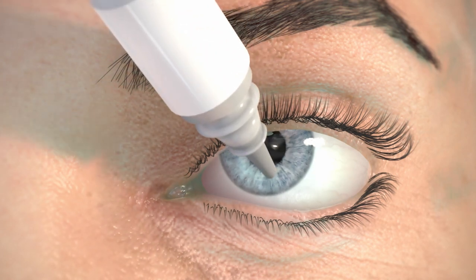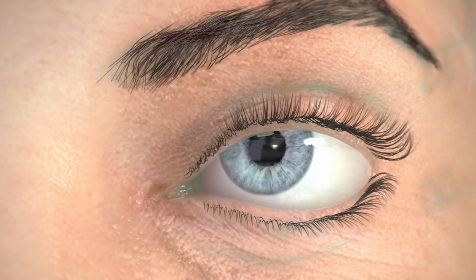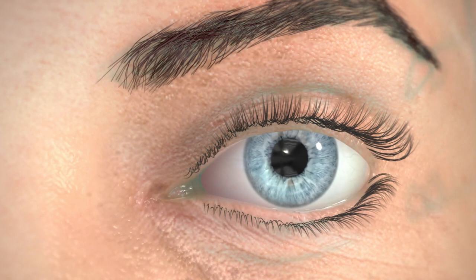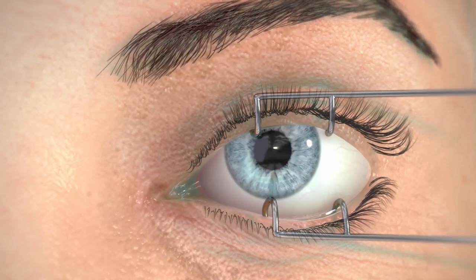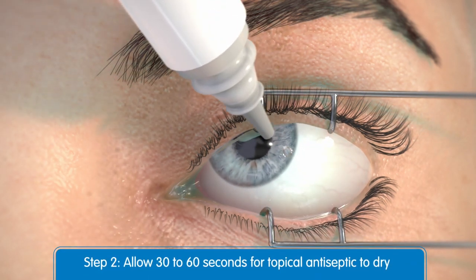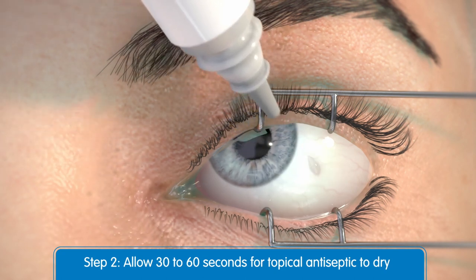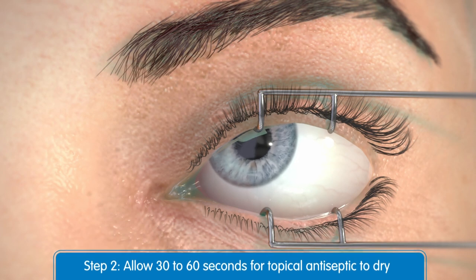Then administer two to three drops of a broad-spectrum microbicide into the lower fornix. The lids may be scrubbed with cotton-tipped applicators soaked with a broad-spectrum microbicide. Then place a sterile lid speculum around the eyelids. Advise your patient to look up and apply additional microbicide solution to the injection site. Allow 30 to 60 seconds for the topical antiseptic to dry prior to injection of Utique.